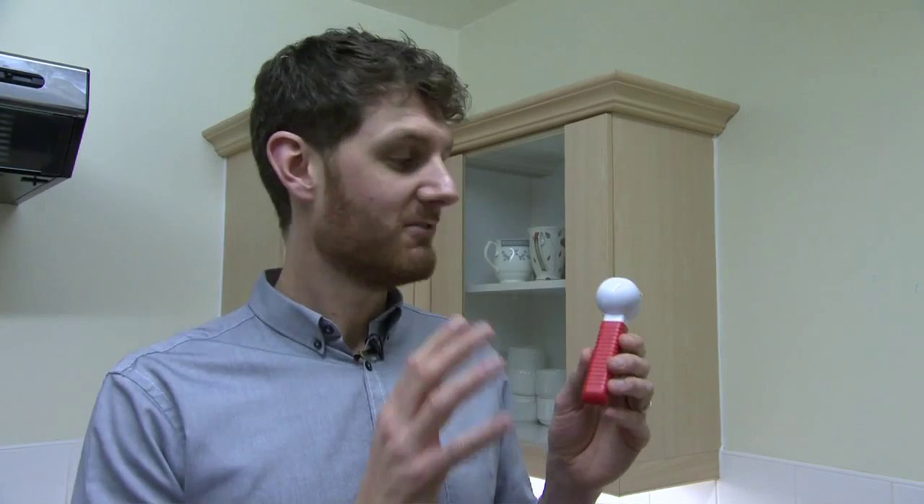This is a tap turner. It's useful for people who find it difficult to turn ordinary kitchen taps or bathroom taps on or off, or spot which is the hot tap and which is the cold tap. There are a couple of different types of tap turner and they fit onto most kinds of tap.